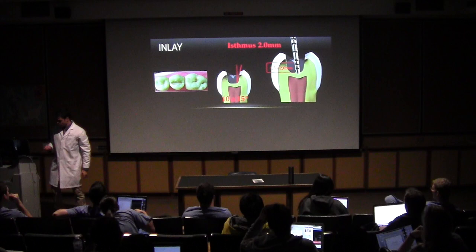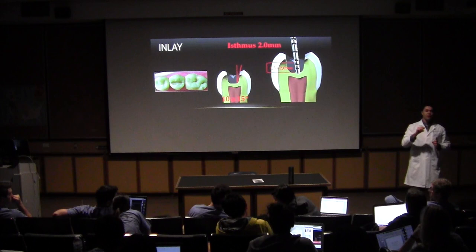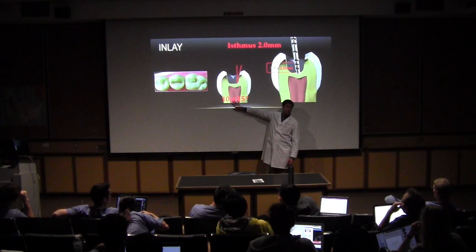That is the natural inclination of the active tip of the diamond point. Okay? You don't need to tilt the head of the handpiece to achieve this inclination. The diamond point will give you this divergence here. All right? Is it clear?